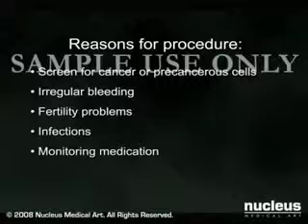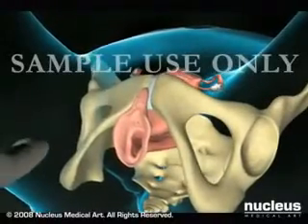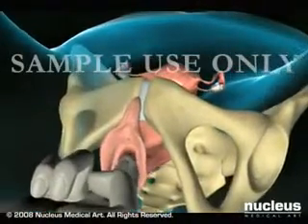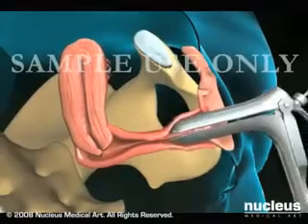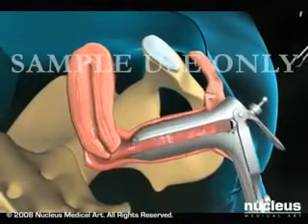An endometrial biopsy can be done in your doctor's office in 10 to 15 minutes without the use of a sedative. Your doctor will first do a manual exam to determine the position of your uterus, and then place a speculum in your vagina to open it up and keep it open so the cervix is visible.